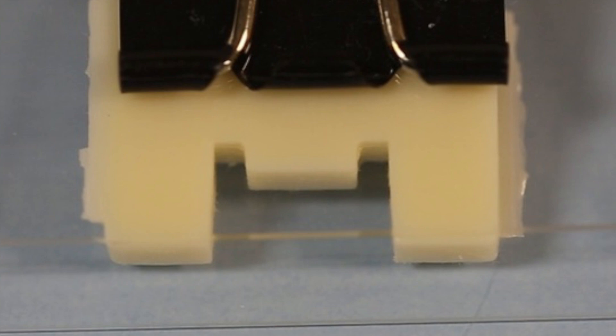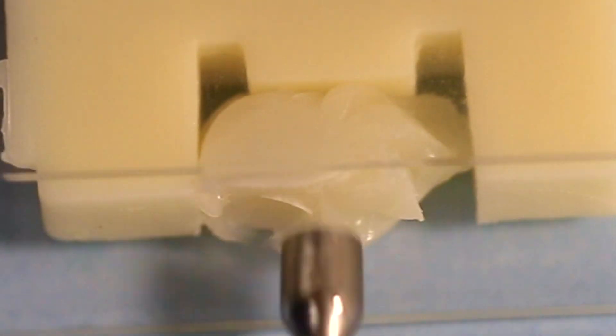Now here we can see putting some bulk fill material into the cavity and packing it in. Obviously I've sped it up.